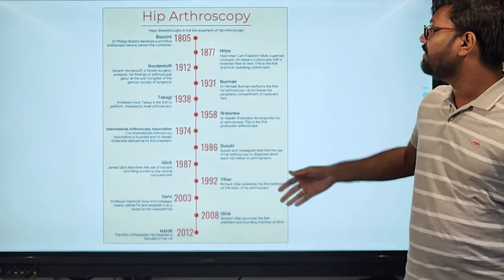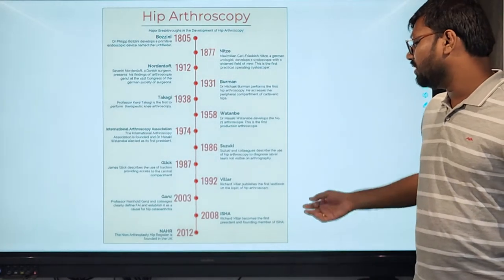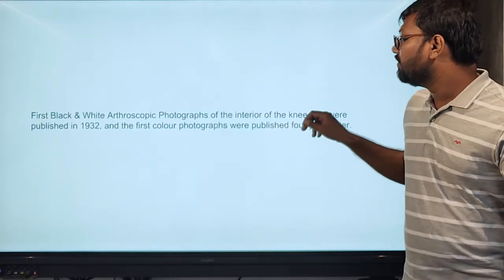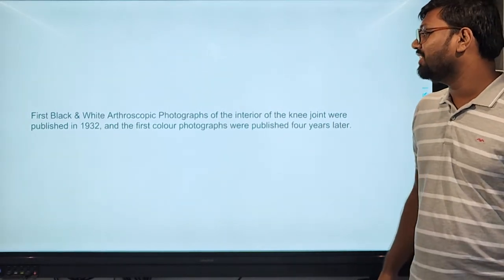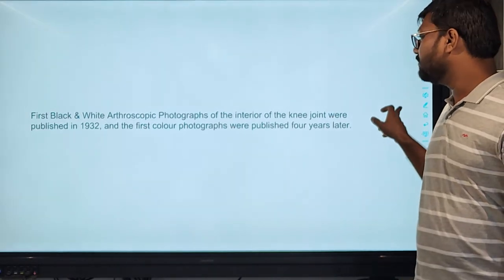This is the timeline for arthroscopy instrumentation from 1805 to recent hip arthroscopy and small joint arthroscopy. The first black and white arthroscopic picture was taken of the knee joint in 1932, and the first color picture was taken 4 years later.